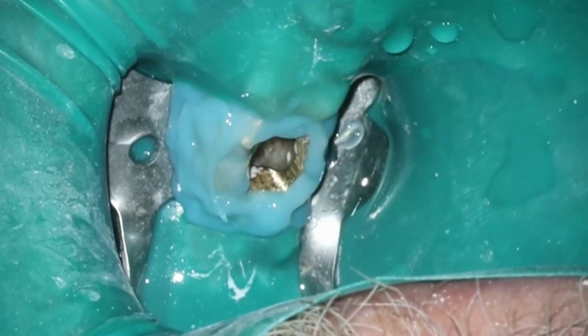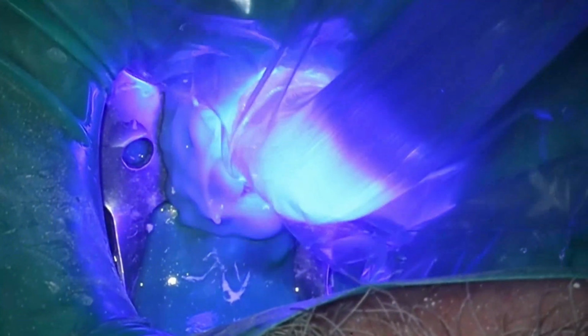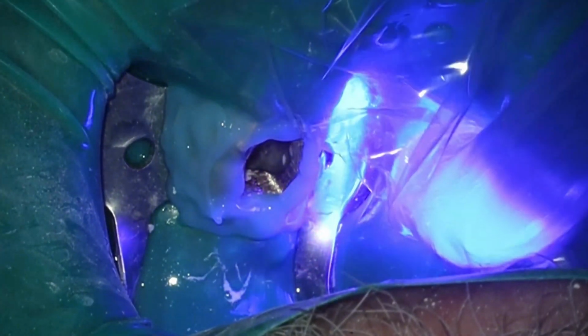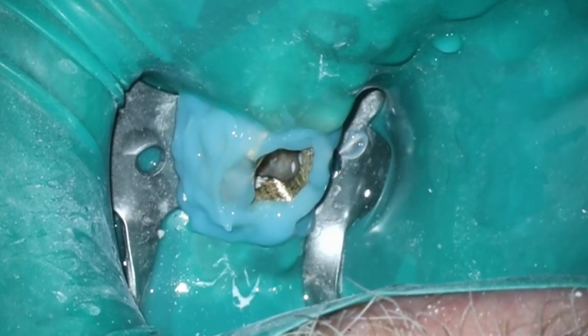So with the SoundSeal, I'm finding that it's best to just completely cover the tooth. I know with the CleanFlow, sometimes you can get away with just doing the coronal aspect of the crown, but I found that it tends to leak. It's not as stable either, and it's more predictable to completely cover the tooth, both buccal and lingual, just to kind of get it all sealed up.